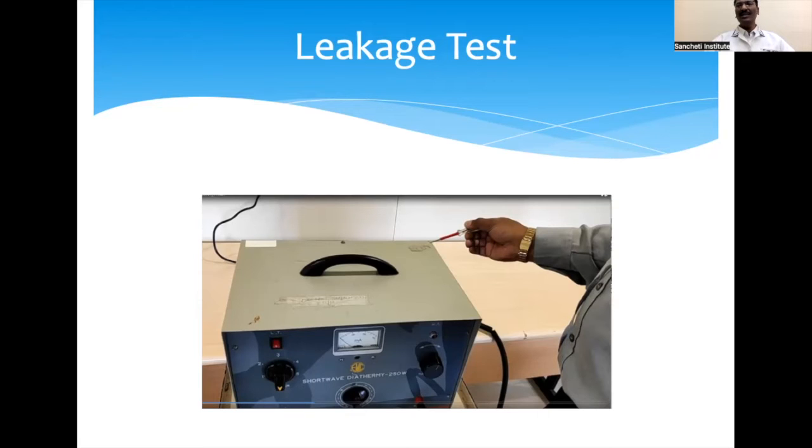On the paint, checking the leakage is of no sense. We have to check in those areas where the paint is scraped off or on the metal clips. Ideally, if you find any leakage, the tester will glow and that will tell you that there is some leakage in the apparatus and it has to be sent for service.